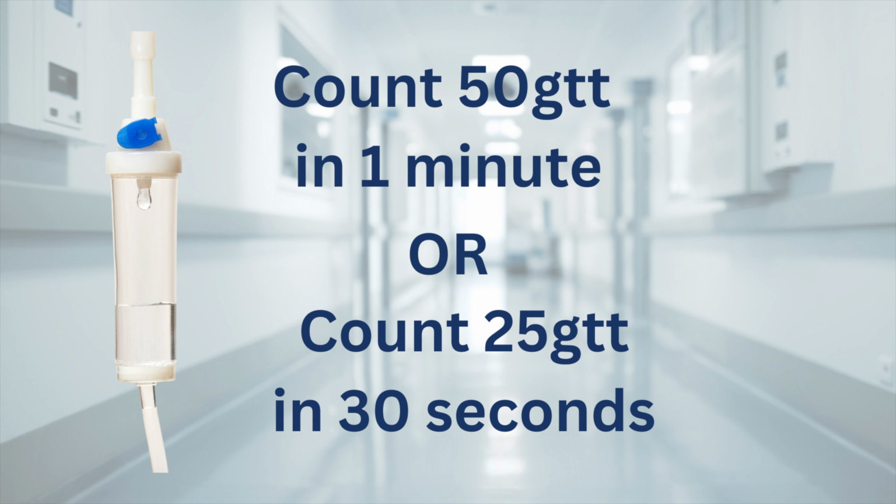When in doubt, always ask for another RN to verify your work and ensure accuracy. Remember, our highest priority when administering medication via gravity is to ensure patient safety and that we are accurately infusing the patient. Always ask for help and have your work verified by another RN if you are unsure.